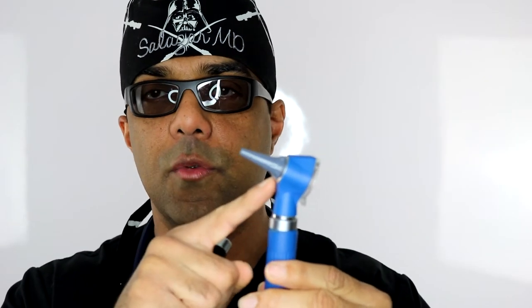But first off, this is an example of a typical otoscope. This is a portable one. And what you'll see is that at the tip, there's a little introducer. That's what we use to insert into your ear. And the reason we use the introducer is because it would not be sanitary for us to use the same tip from one patient to the next.